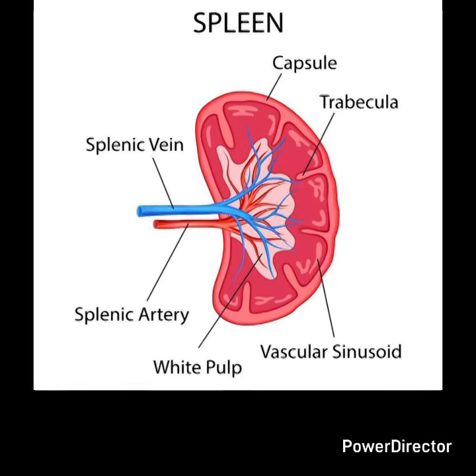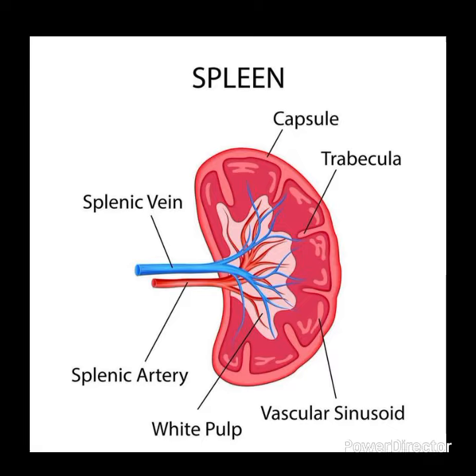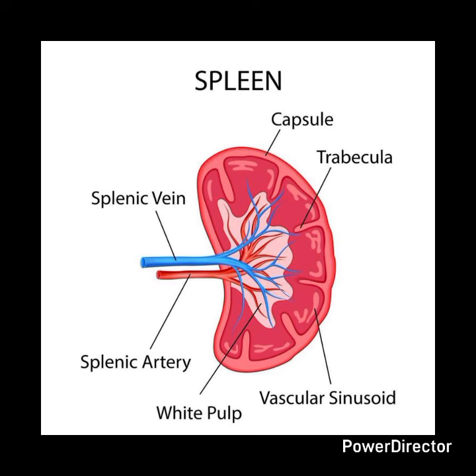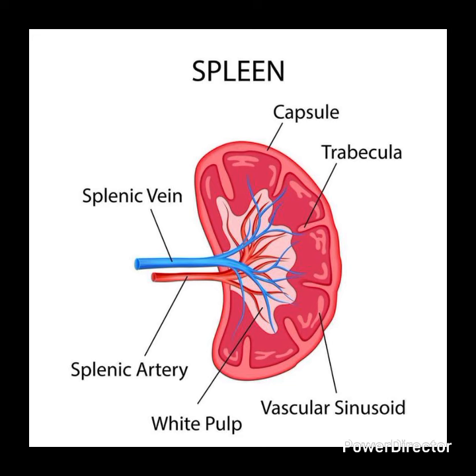Fourth one is partial splenic embolization. It targets 50 to 70% of the spleen, often for hypersplenism or portal hypertension, to balance efficacy and safety. Selective embolization of mid-lower pole branches minimizes complications like pleurisy. So what are the four? Proximal splenic artery embolization, distal splenic artery embolization, combined embolization and partial splenic embolization.